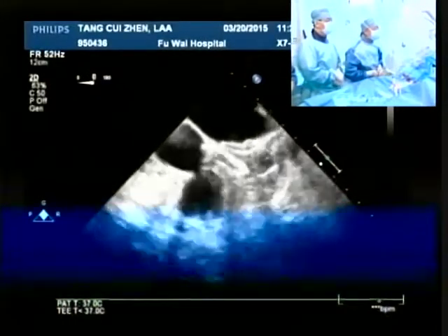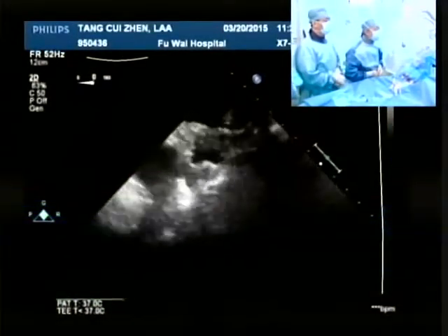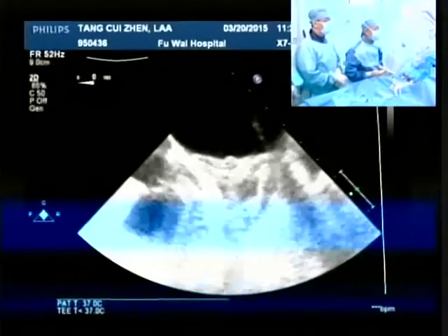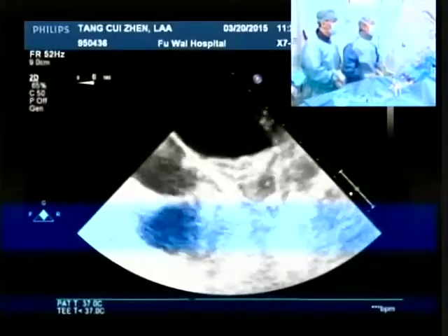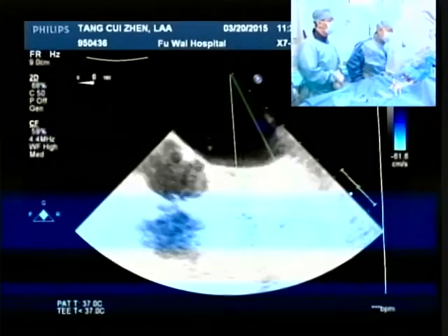Can you bring the color here? Turn toward the pulmonary vein, it seems the pulmonary vein is not blocked, they are a bit worried about that. I like the result, but the pulmonary ridge is not really covered. It's different from what you do otherwise, right? Yeah, but the pouch is not that pronounced. Agree. And therefore, I think this is a good result.